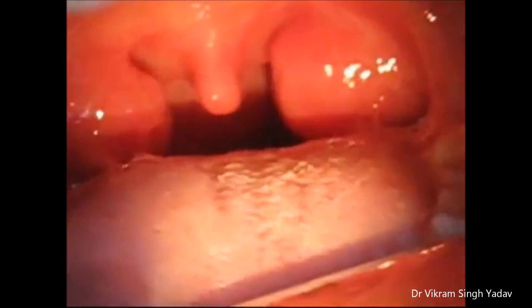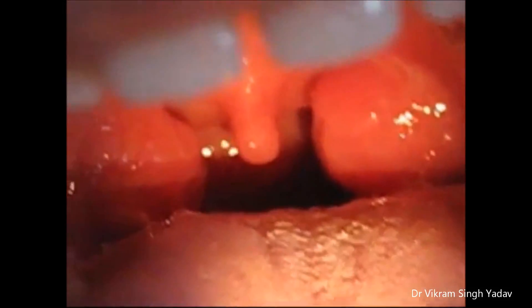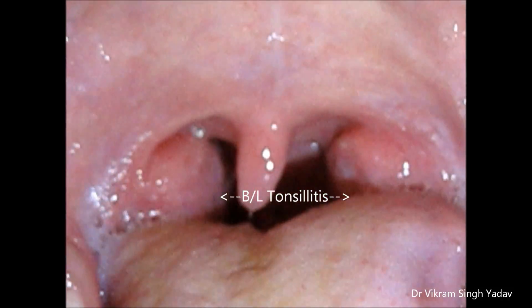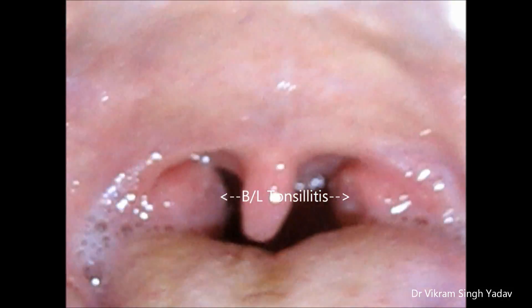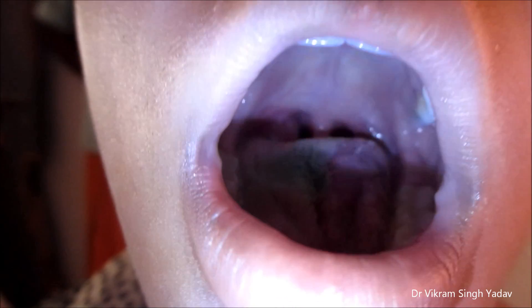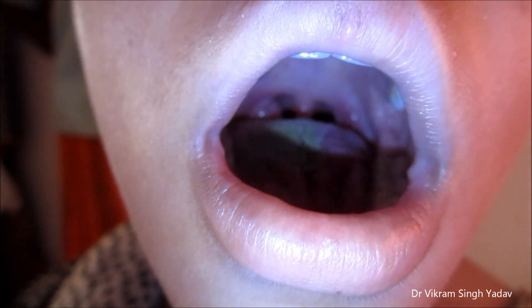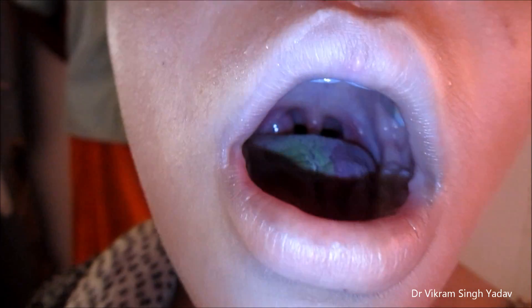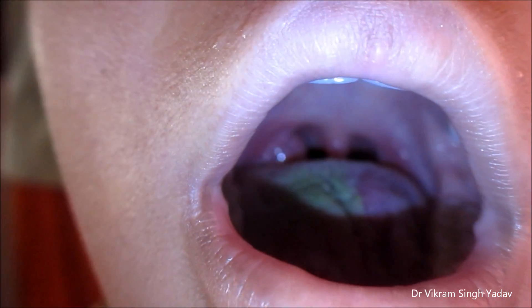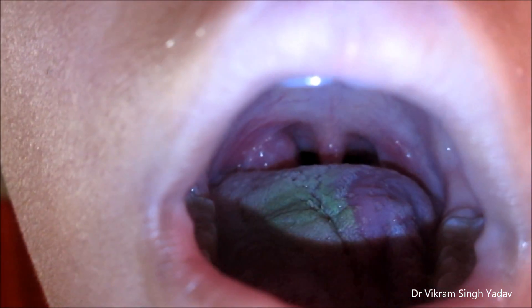I'm going to tell you how to examine the tonsils. You need a tongue depressor and a light source. The tongue depressor we are using already has the light source inbuilt in it. Ask the patient to open the mouth and depress the tongue with the tongue depressor.